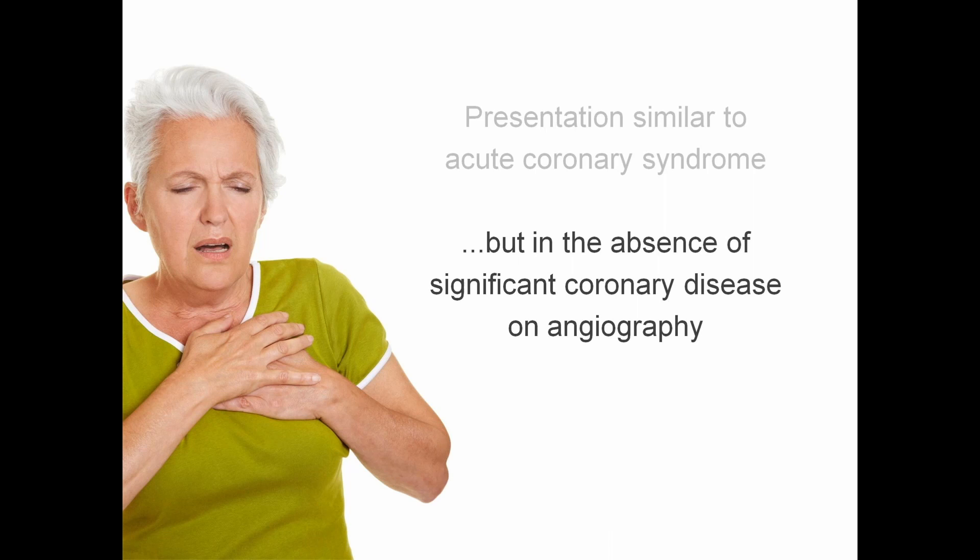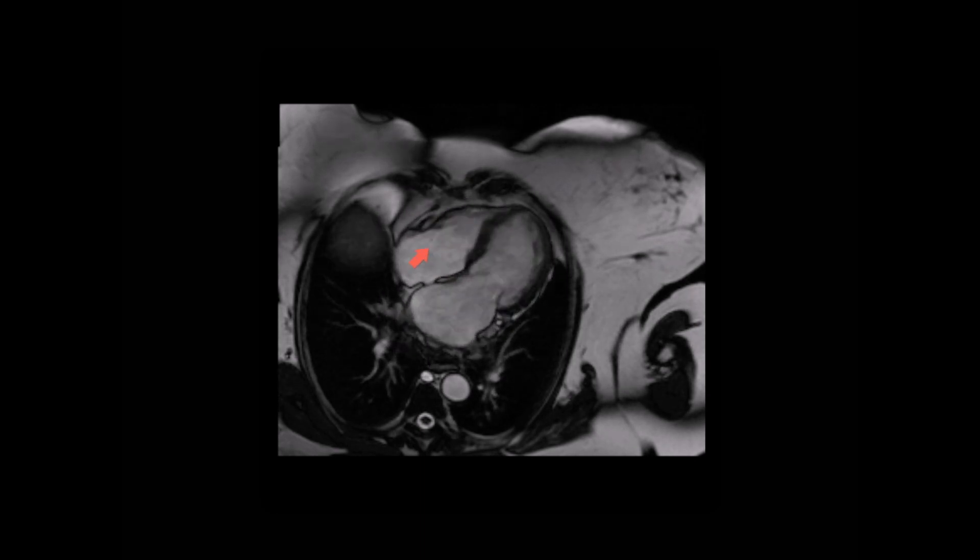So what can CMR offer us diagnostically in the assessment of this condition? Here's a cine CMR image taken in the four-chamber view. We have the left ventricle, left atrium and mitral valve, right ventricle, right atrium and tricuspid valve. What we see in this patient with Takotsubo cardiomyopathy is ballooning and virtual akinesia of the left ventricular apex, which is a very characteristic appearance.